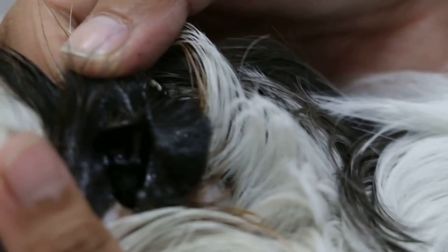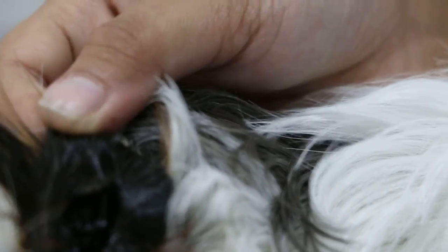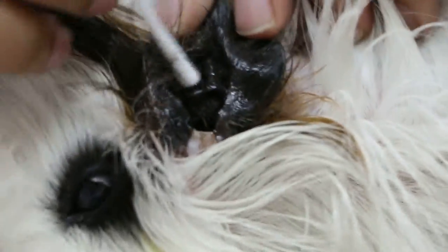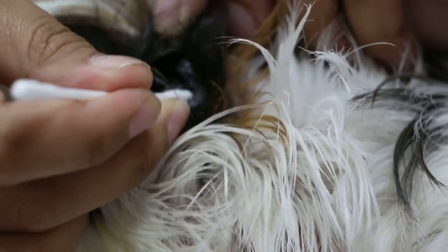When I check the ears — take the cotton bud, the thin one. The owner finds it difficult to put ear drops after three days. You hold him — use the thin one. Still having head tilt. How's the left ear? That's the left ear. Hold firmly. Maybe it's painful — he doesn't like it. Okay, we need to irrigate the ears. Is it dirty? Black. I'll irrigate the ears — the other one also he doesn't like.